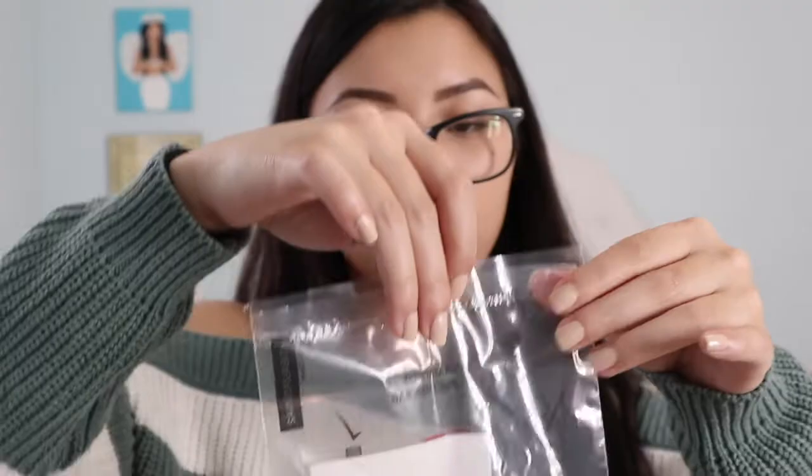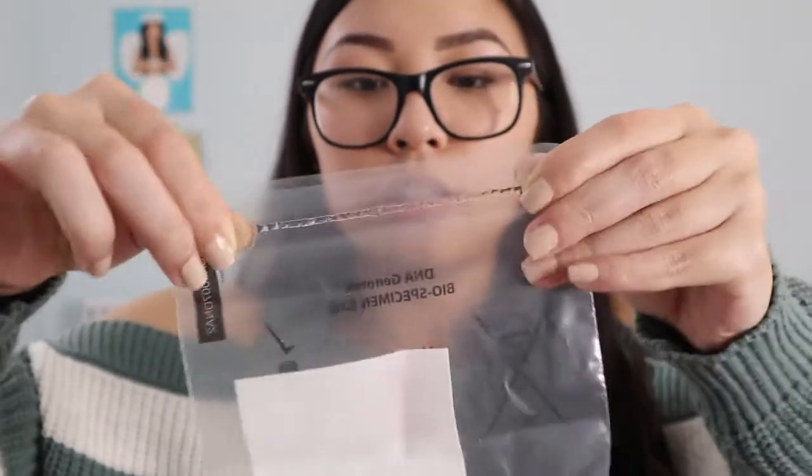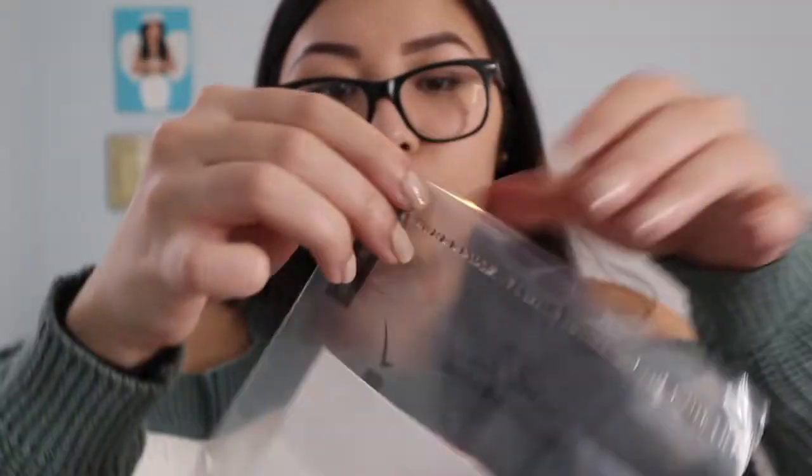Here's our bag, we're gonna put it in here, then we take off this blue thing. It's like a ziploc bag — you just press on the glue. Now all we gotta do is put it into this box. We're good to go! Next time you guys see me it's gonna be another day and then we're gonna check my results of what's my ancestry and my health.